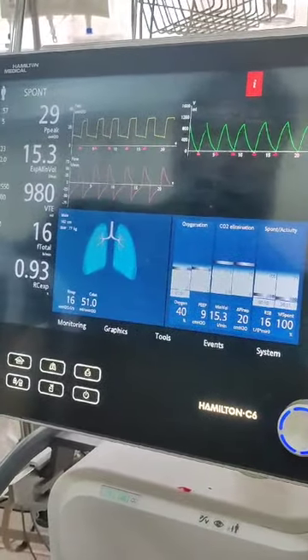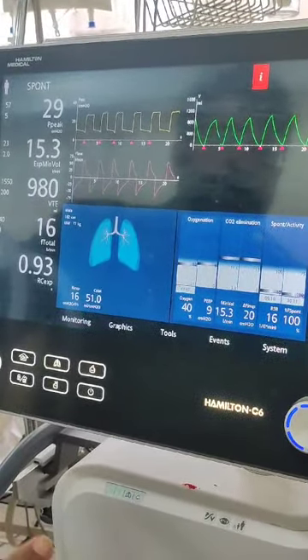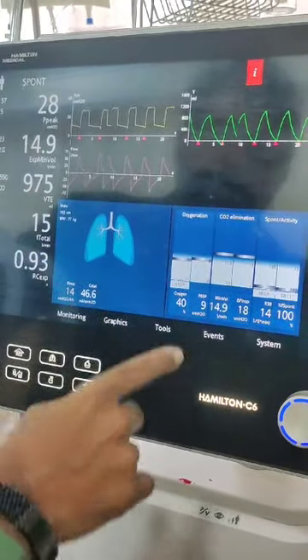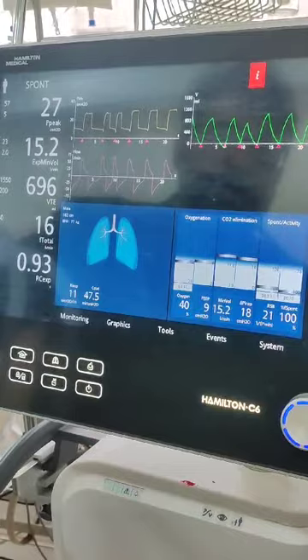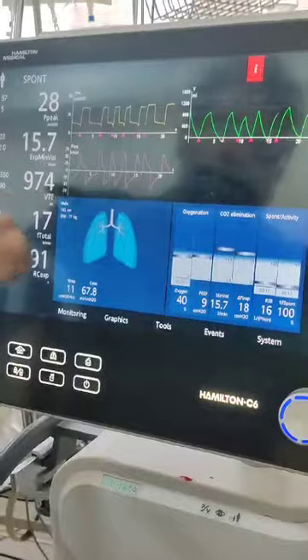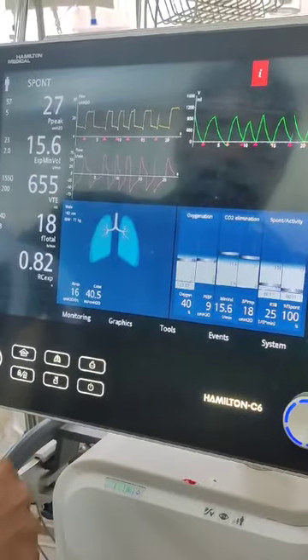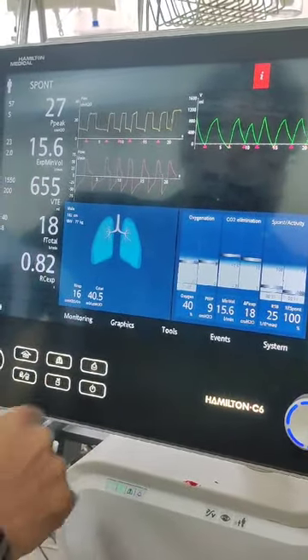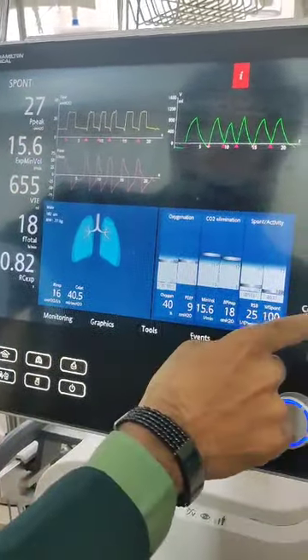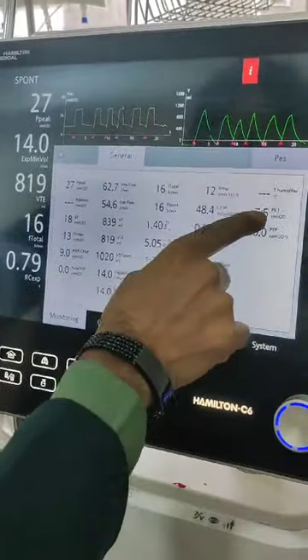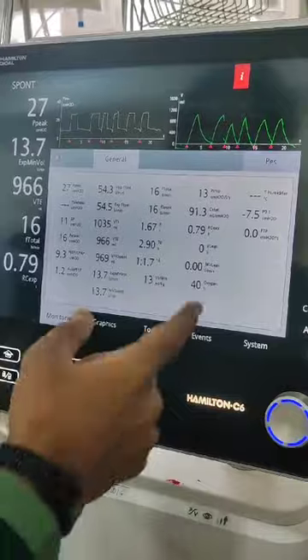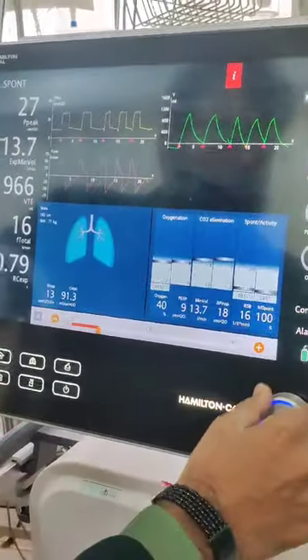Tidal volumes are at 900 — very high. I think this patient is not ready for a spontaneous breathing trial. However, these high pressure supports are generating such high tidal volumes. For a big gentleman over 100 kilos, I would target around 600 as the average tidal volume. It appears he's getting around 600 now. The waveform looks stable and P0.1 is maintained at 7.5, not 22 or 21 anymore. So maybe he doesn't need quite that much support — let me try less.